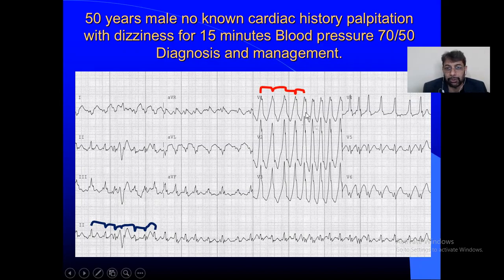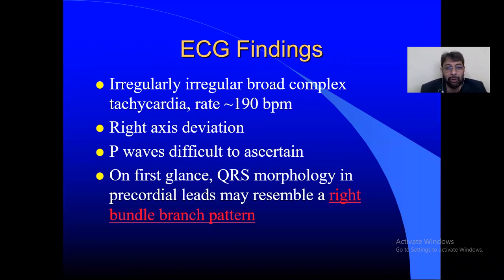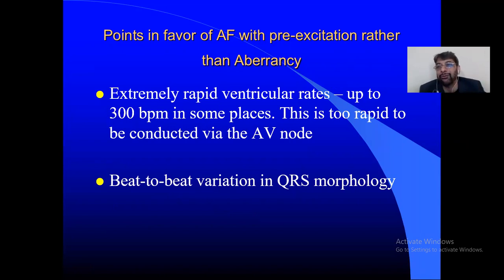It resembles RBBB no doubt, but the morphology is constantly changing — this is a big clue towards the diagnosis. In this ECG: irregularly irregular, broad complex, rate around 190, right axis deviation, and P waves are not present. On first glance QRS morphology may resemble RBBB. You can now consider two possibilities: AF with pre-existing RBBB, or Ashman phenomenon giving a broad complex — but here we have changing QRS morphology.